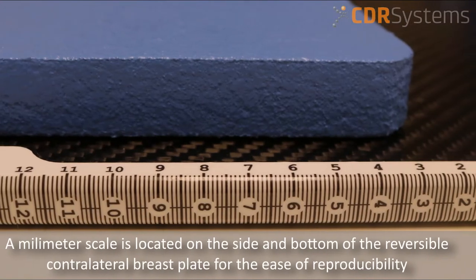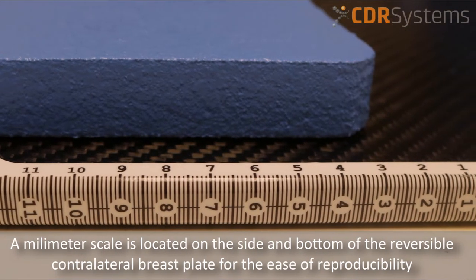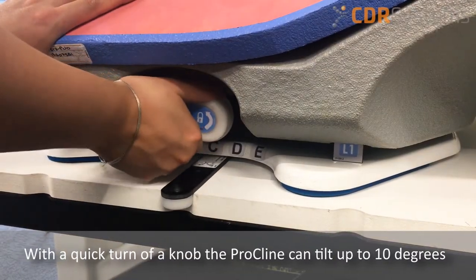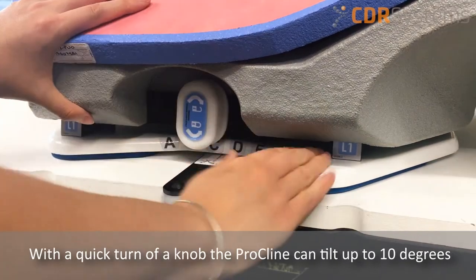A millimeter scale is located on the side and bottom of the reversible contralateral breastplate for the ease of reproducibility. With a quick turn of a knob, the Procline can tilt up to 10 degrees.